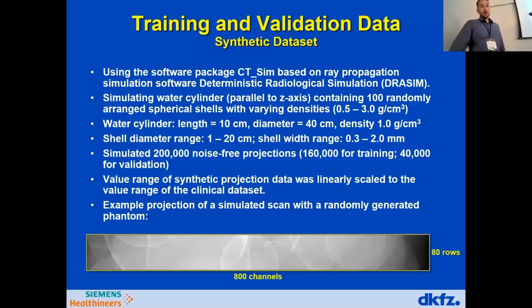All in all, we simulated 200,000 noise-free projections, whereas 160,000 were used for training and 40,000 for validation, and the value range of the synthetic projection data was linearly scaled to the value range of the clinical data set.